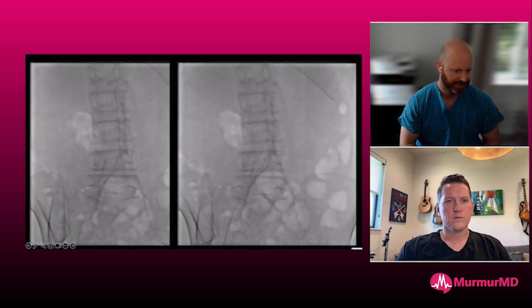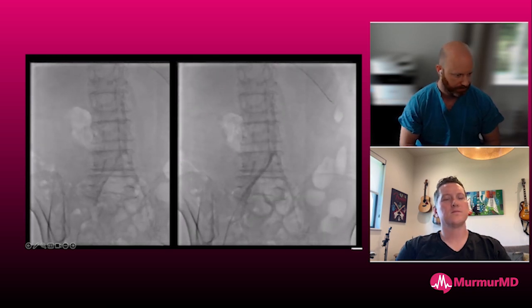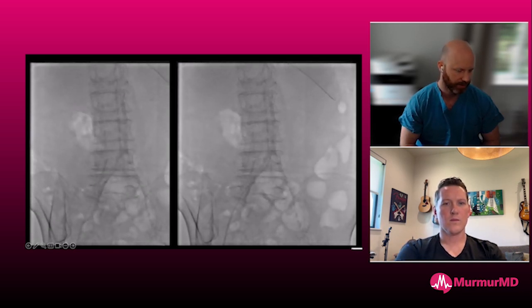And frankly, I've had several of them that just thrombose within like the first hour. So really our goal is to work as efficiently as possible. You can have lower extremity ischemia for short durations and do fine. We know that from acute limb ischemia, and we get some flow around the sheath. We're going to adequately revascularize this to a size where we're not going to be completely occlusive, hopefully.